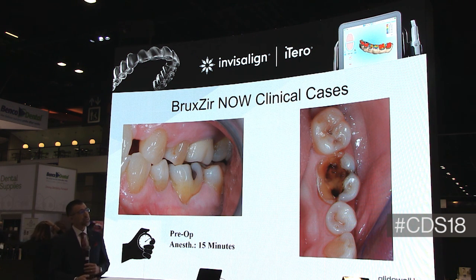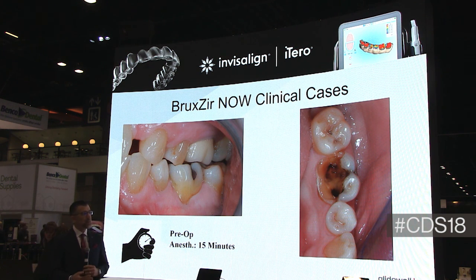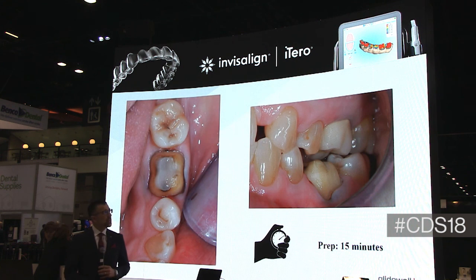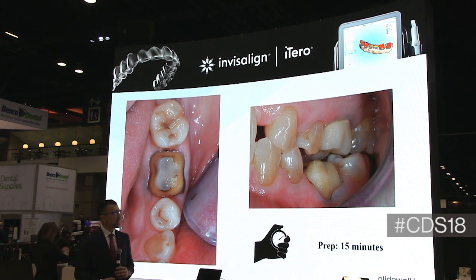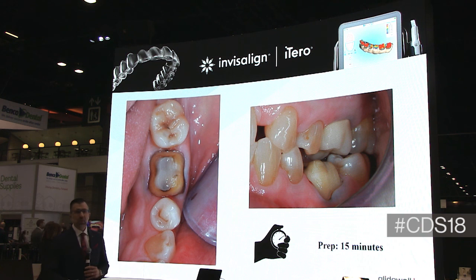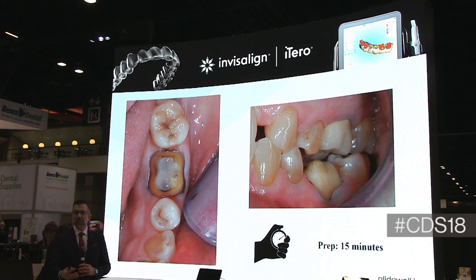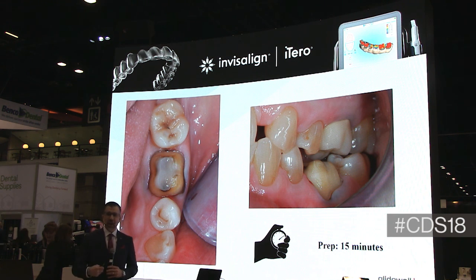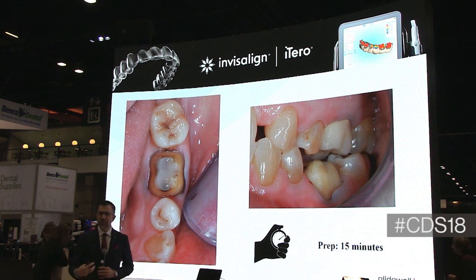And with the patient presenting like this, it would have been hard to make a matrix to fabricate a temporary, so I would have needed a prefabricated temporary. So anyways, we prepped the tooth. On zirconia restorations, they're not necessarily a bonded restoration, so you want to make sure that you have good axial wall height. On this case, we had that, so I felt confident that zirconia would be a good choice in this situation. And also, when you're looking at this patient's teeth, although she's a wonderful lady, we can tell that she's probably not a runway model with these teeth, and she's got a lot of grinding habits that are affecting her occlusion, so I wanted a very strong material for this lady.